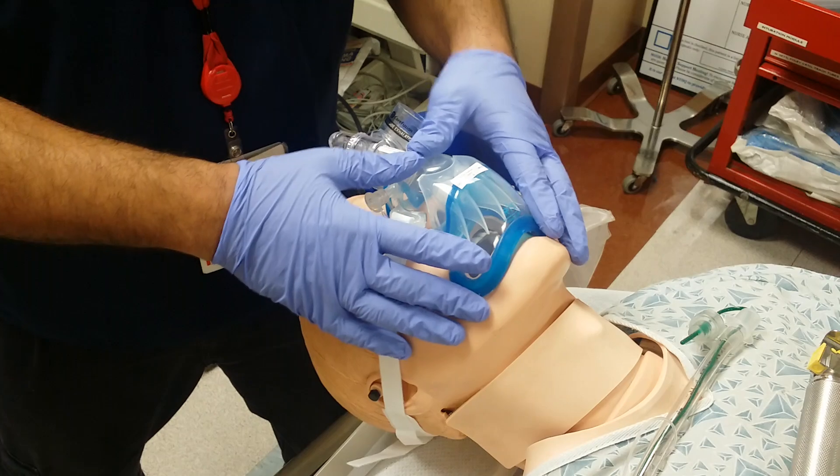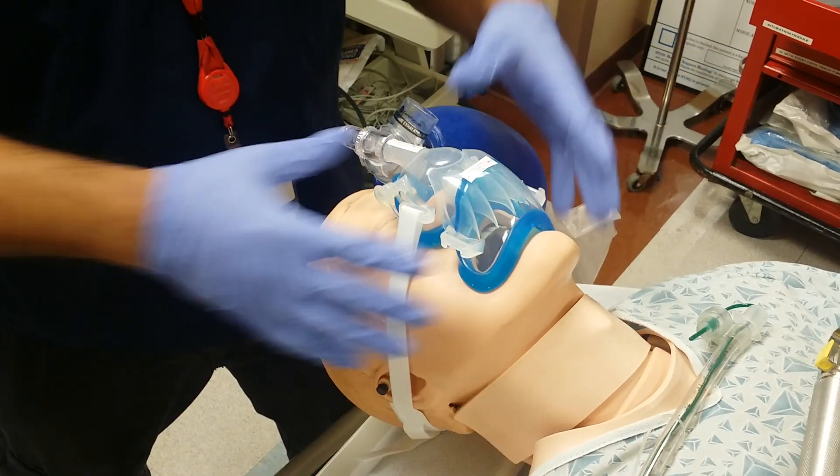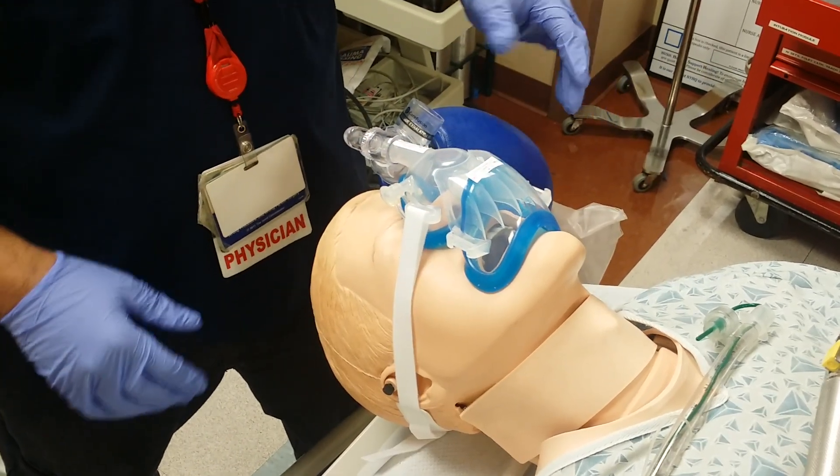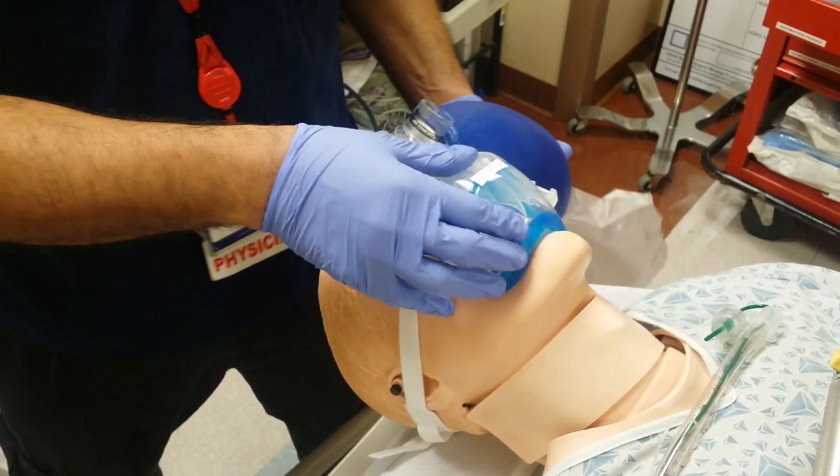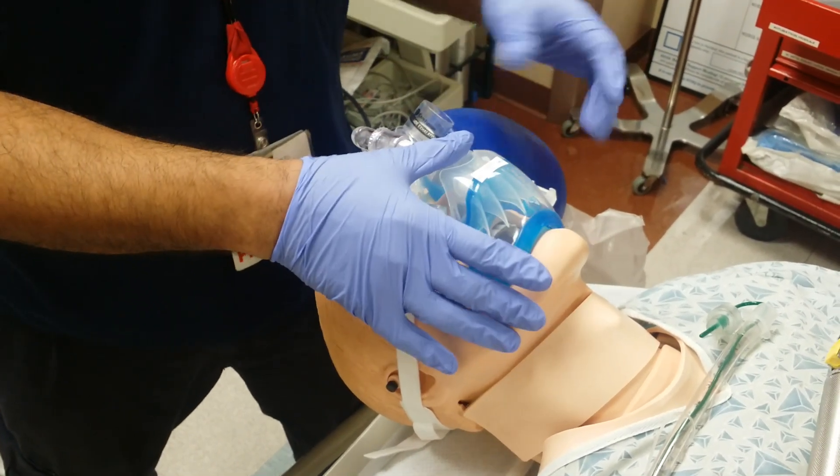If I've already pre-oxygenated and made a decision to intubate, I will proceed. You can actually continually bag the patient, or have him connected to a CPAP or BiPAP machine, or to a ventilator on non-invasive mode.